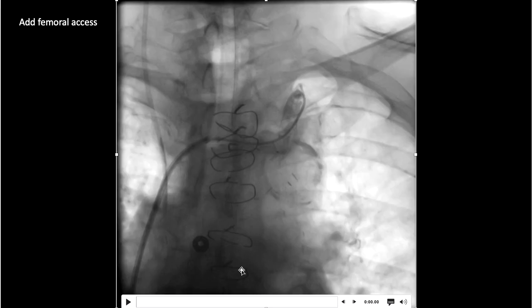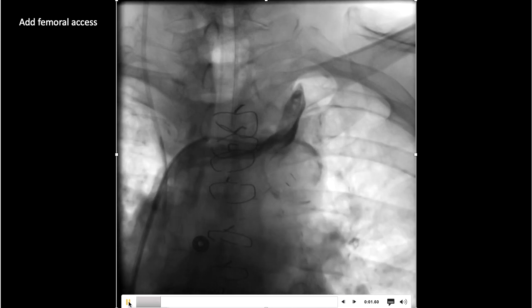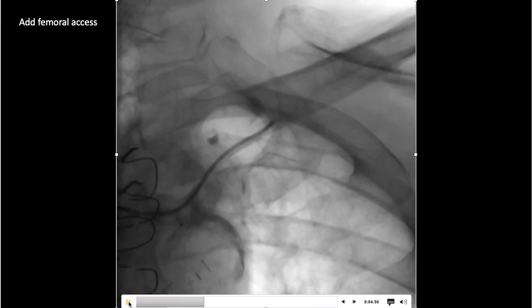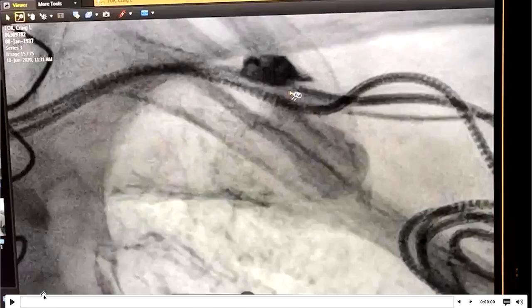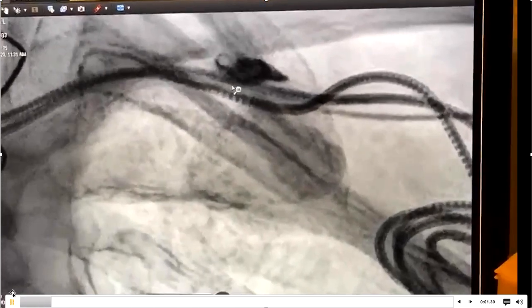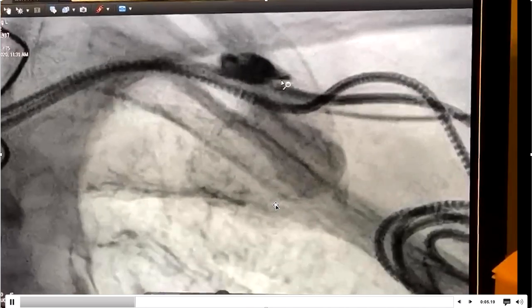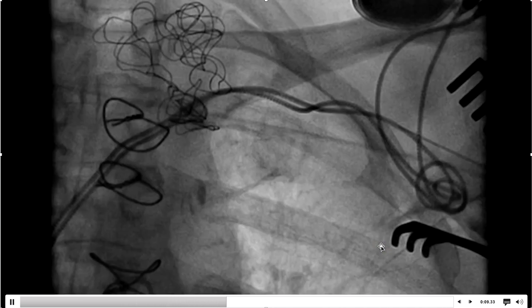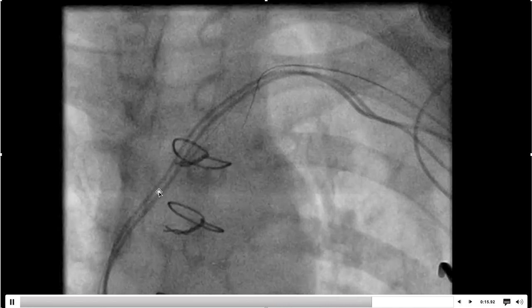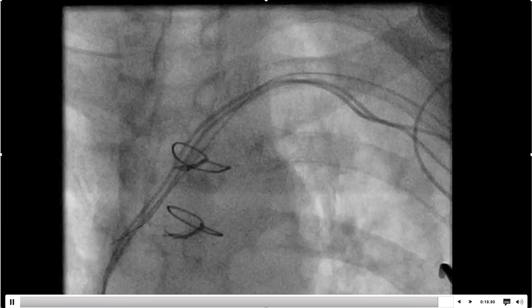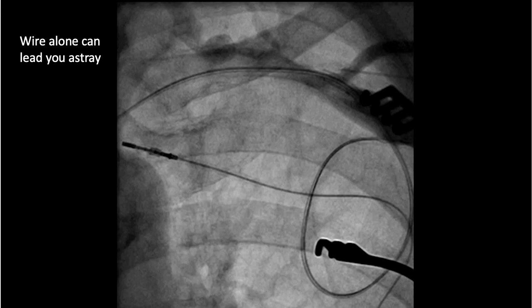Adding femoral access can be helpful if you can't get access from above. By defining the extent of the occlusion from below, you'd be surprised sometimes how far you can go. Here we're working the catheter all the way up — and notice we're using the catheter alone, not relying on the wire. This example shows a case where the stick was too far central and the wire couldn't get through the occlusion. Starting caudal made it easy to stick the vein and get through the occlusion quickly. It's really important to stick the vein caudal to the occlusion.